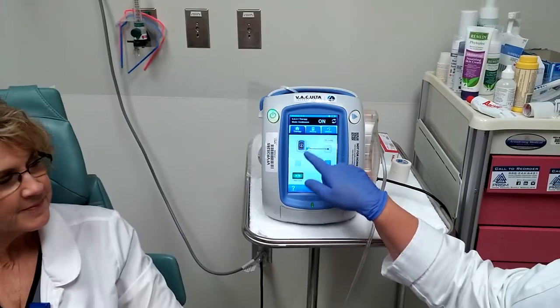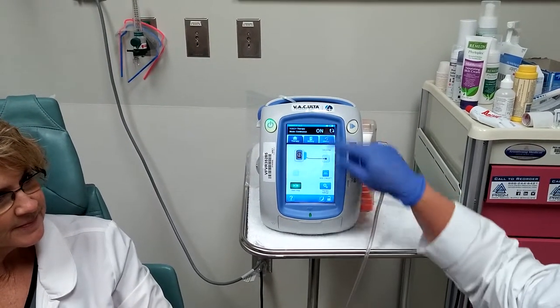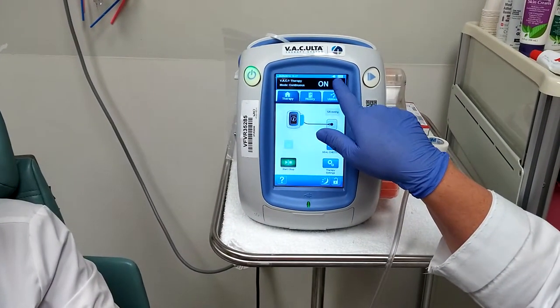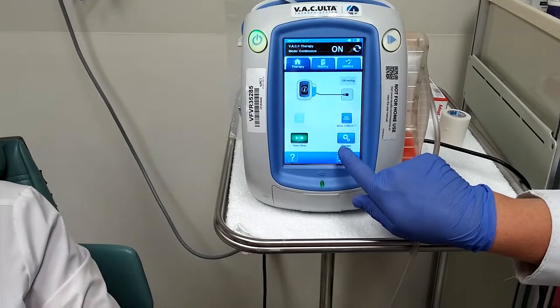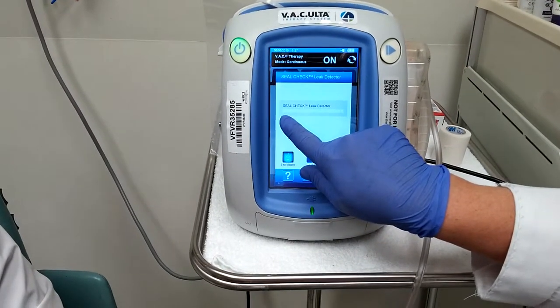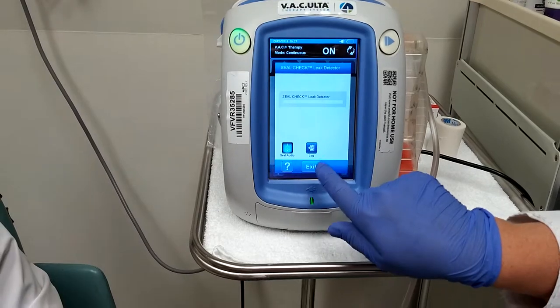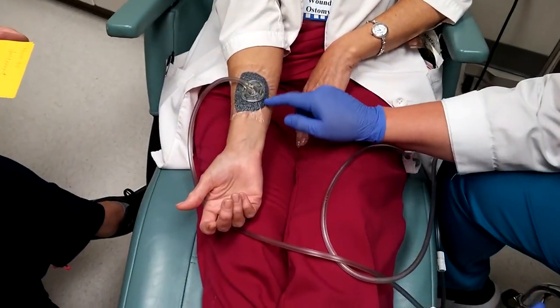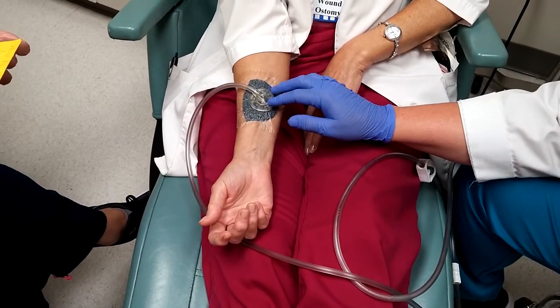You'll have a long description of troubleshooting on the orders typically, but that's kind of boring to read. The things that you want to watch for are: the jar is filling up — that means it's going, the little circle is going around, the battery is being charged, there's the seal check leak indicator and it's down, so it's telling you that it's a good seal. The other way that you note it's a good seal is it looks like a raisin — the dressing sucks down and it looks like a raisin, it's all wrinkled.